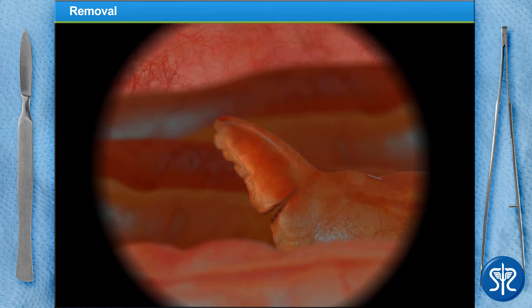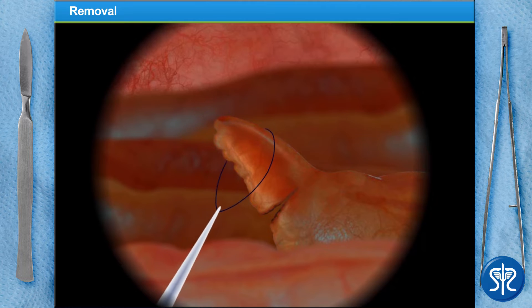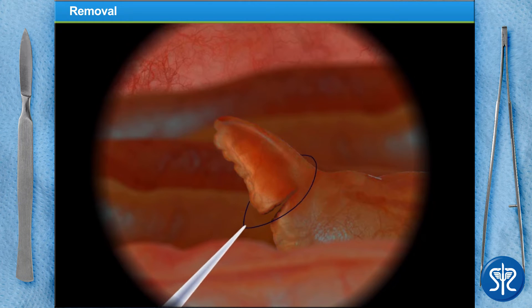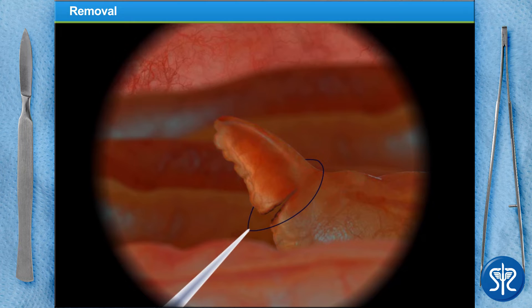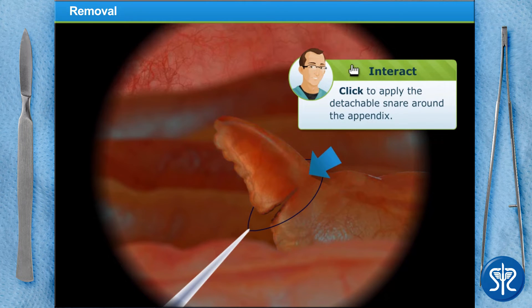The appendix now needs to be lassoed with a detachable snare. Take the detachable snare and slide it over the appendix all the way to the base. Repeat this step two more times, placing two more loops above the first one.